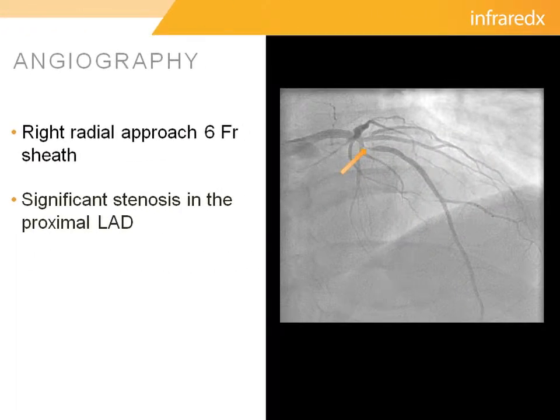Initial angiography was performed from a right radial approach using a 6 French system, and as you can see by the arrow here, we see a very significant lesion in the proximal LAD. But it was unclear exactly how far this lesion extended, both proximally and distally. You can see it arises at the takeoff of a pretty sizable diagonal branch, and there was concern that it may have extended back into the left main.